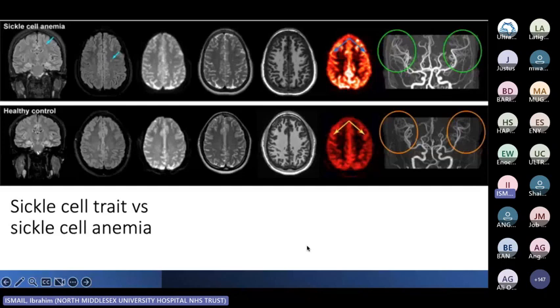So obviously, even if there isn't any infarctive event, there is much more volume, and that could be due to a deficit region. The vessels themselves don't have to be occluded for them to be affected, and in that respect there are higher volumes in the angiogram compared to the control patient here.